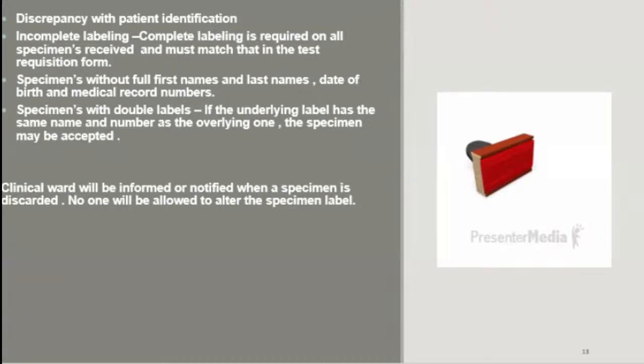The majority of that 118, which was about 68 of those samples, was due to mislabeling. Either the sample and the requisition did not agree, or the information on the sample and the requisition did not agree.